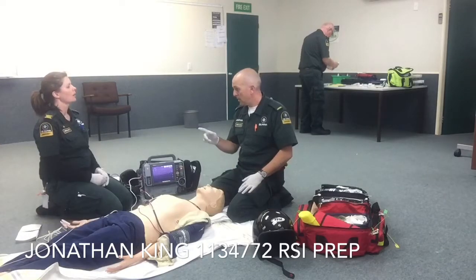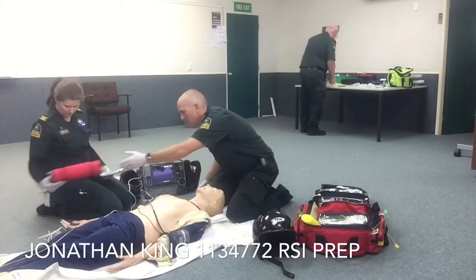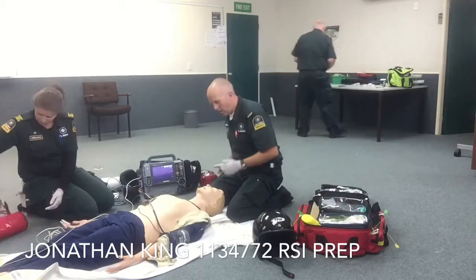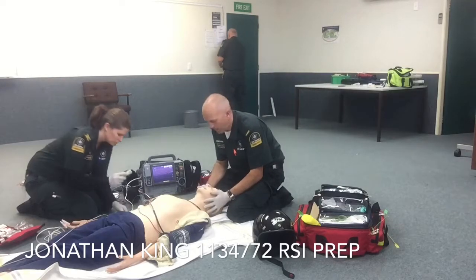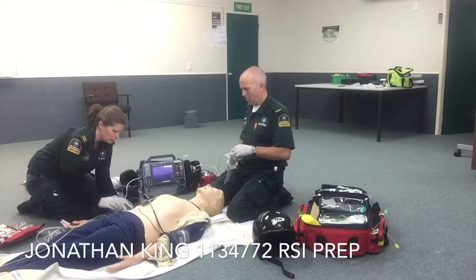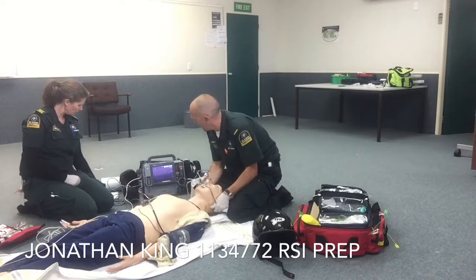Joe, if we could get the prep for RSI checklists. Yep, I have here. And if we can get an IV in too, that would be great. Sure. And we'll hang up some fluids. Got a bag mask here. Does he tolerate a simple airway, OP airway? I have one. Did you want two IVs? Well, at the moment we're fine with that, but we'll just go through that checklist and work from there.